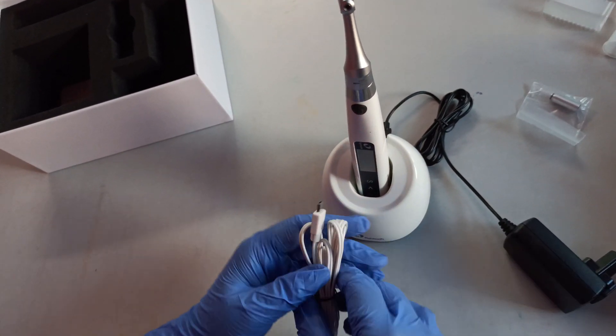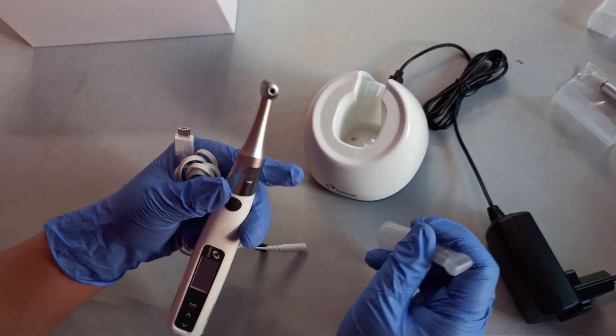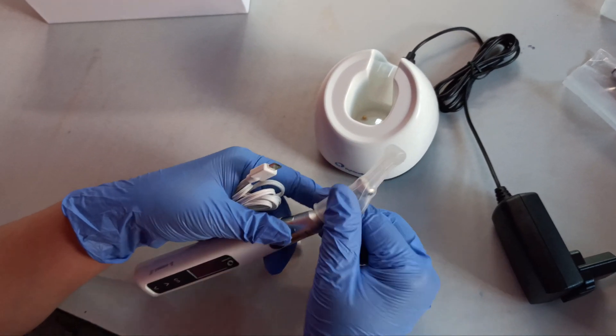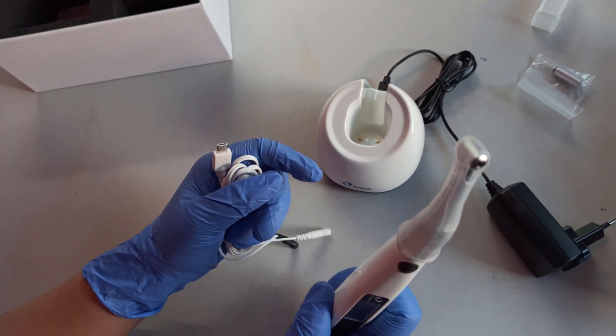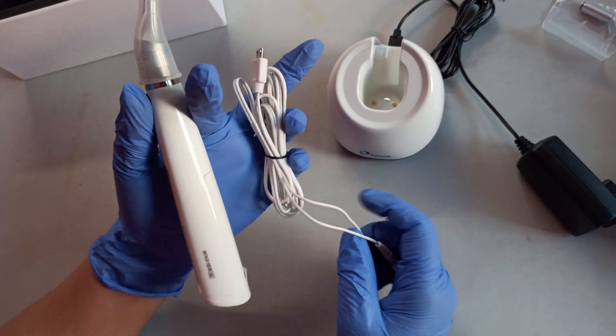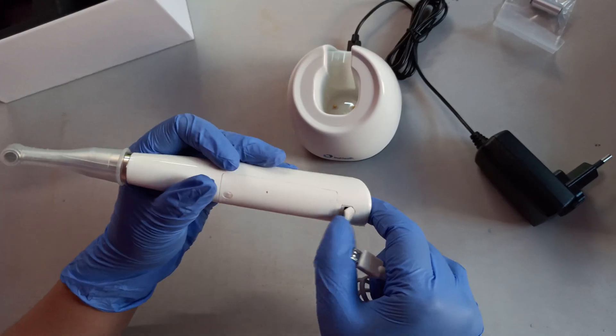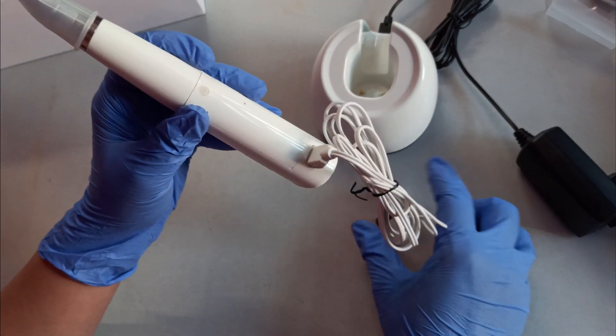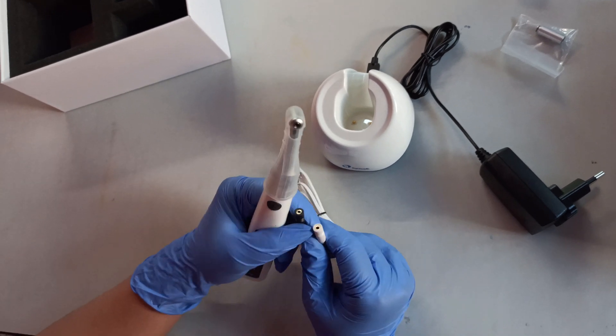For the Apex Locator, please always remember that you always need to insulate the handpiece with an insulating sleeve. Otherwise you won't get proper readings. Now this socket will go into the endomotor, and then you can attach the file clips and the lip hooks.